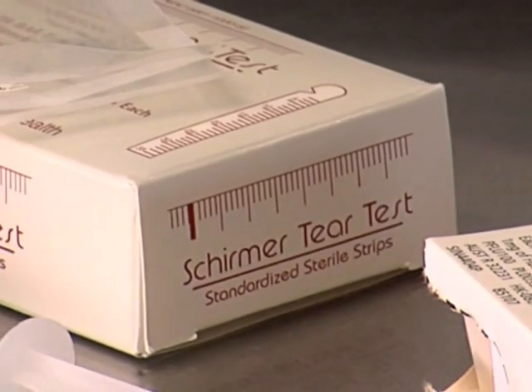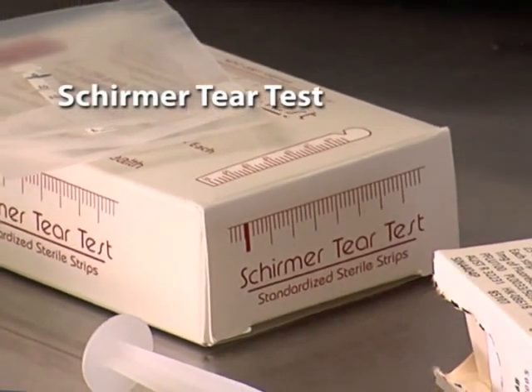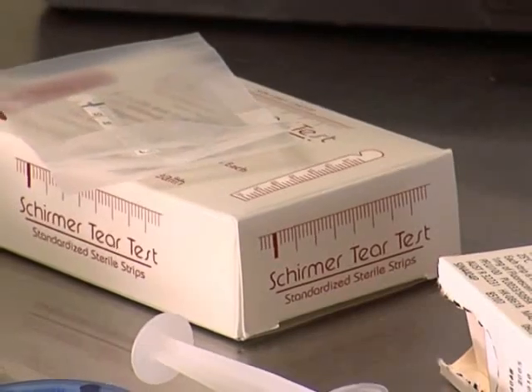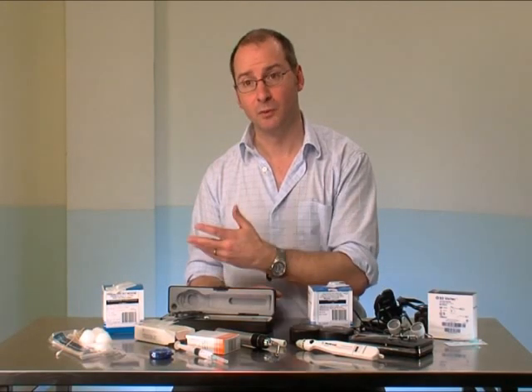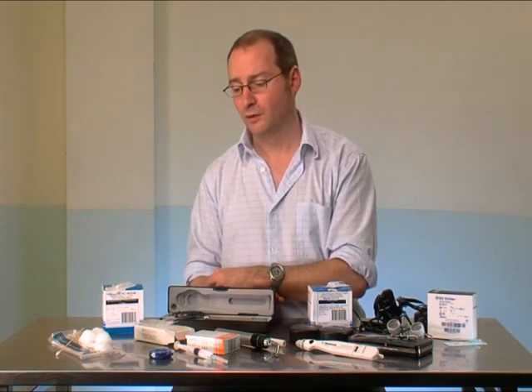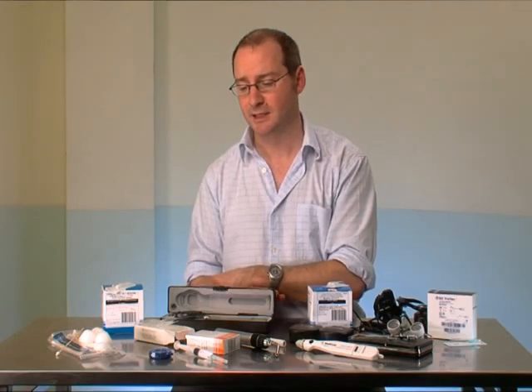If there is reason to suspect that the tear film is inadequate, Schirmer tear test strips are useful for assessing tear production. If you're worried that there's irregularity in the precorneal tear film, or if there's an excessive mucopurulent discharge, then you certainly should be doing a Schirmer tear test.